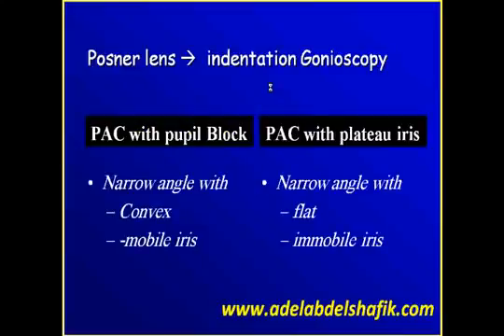So keep in mind that when you do indentation gonioscopy, the purpose is to check the most peripheral part of the iris. Is it movable or not, to know if you are dealing with pupillary block or plateau iris.